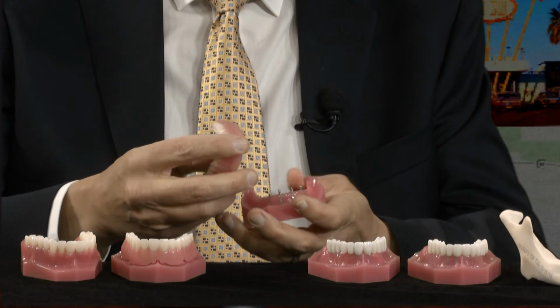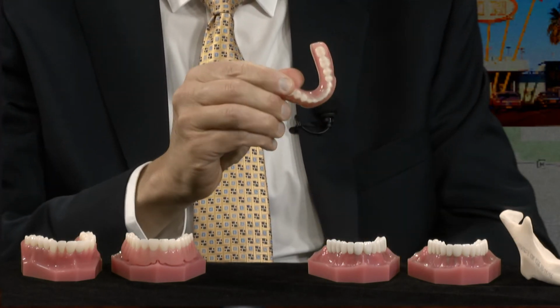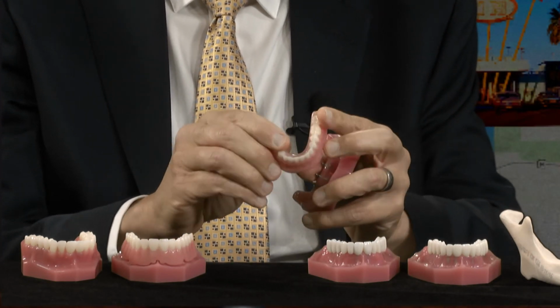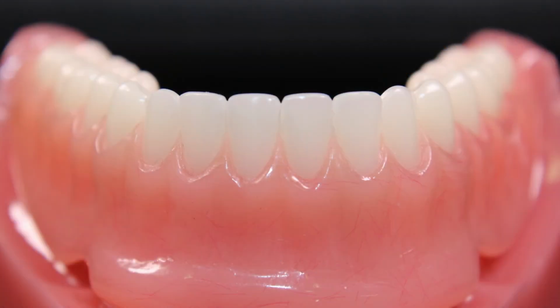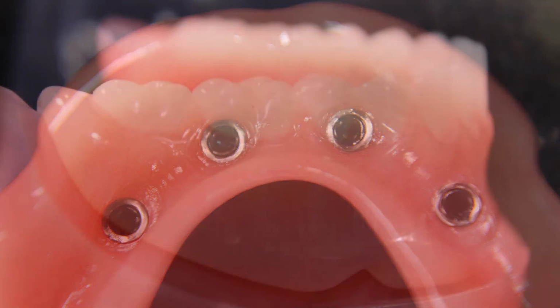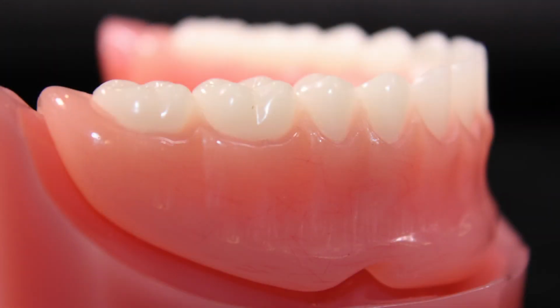Basically what we're doing is, and this looks like pretty much a standard denture, and it is. In fact, if you come in and you've got an ill-fitting denture, depending on the denture itself, if it's thick enough, I can retrofit that denture to a brand new set of mini dental implants, and that's an even more cost-effective way. And do you take the existing denture that the individual has, or do you create something new to snap in place? I can use the existing denture if it is strong enough and in good enough shape. The nice thing is we can place the mini dental implants and use the existing denture as a temporary, so you don't have to ever walk around with missing teeth.